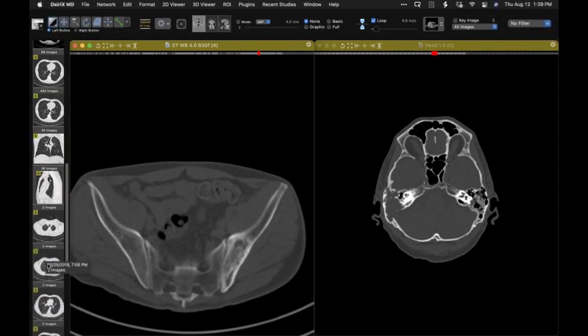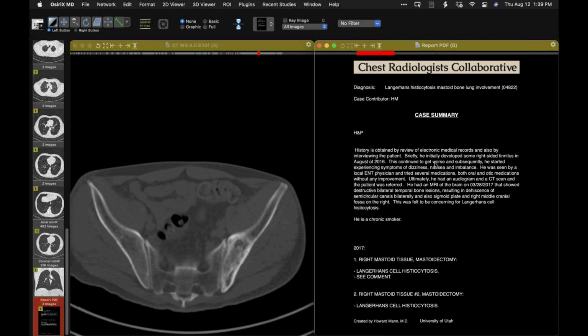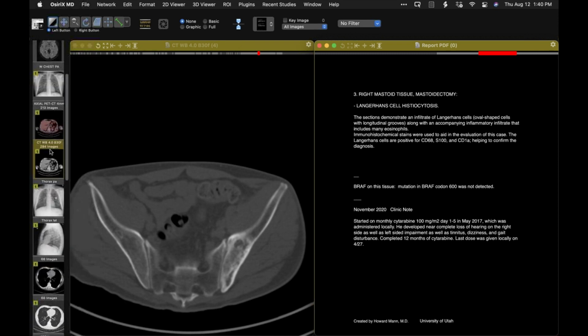So absolutely right. So here is the diagnosis, as you said. They biopsied the mastoid tissue: Langerhans cell histiocytosis. Patient is a smoker. This is not BRAF mutation associated. I think like anything else, not all of them are associated with a positive result for the BRAF tissue, which is what they did look for. But otherwise, that imaging finding I think is very distinctive for what some people call burned out PLCH. Exactly right, that imaging pattern.